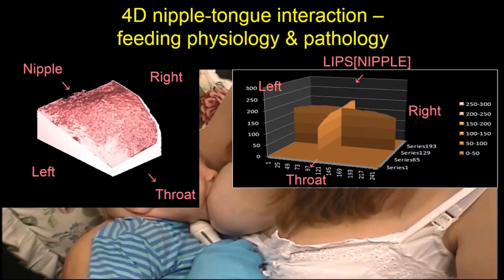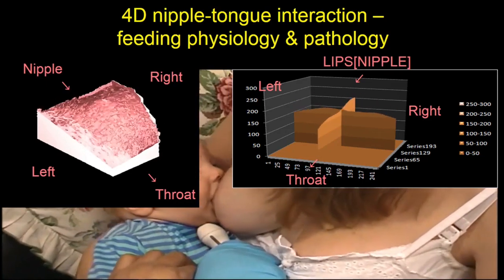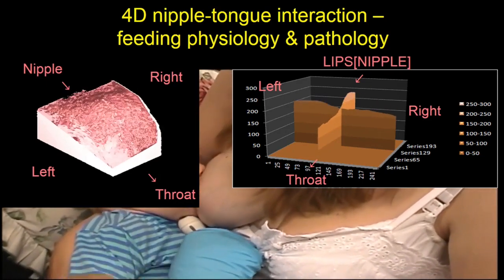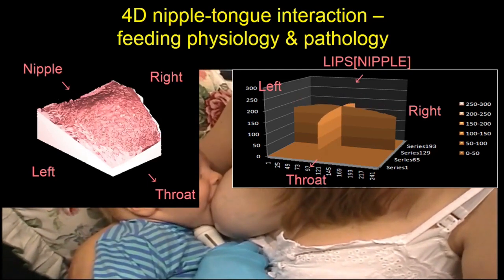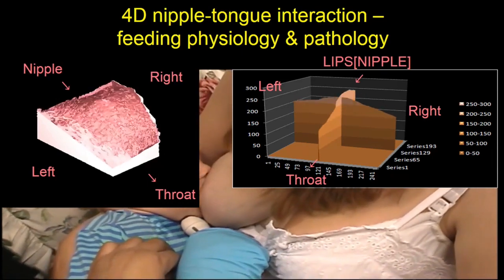So this just shows how we get used to seeing things. When you come to a 3D screen, you may interpret things incorrectly due to your pre-perception.